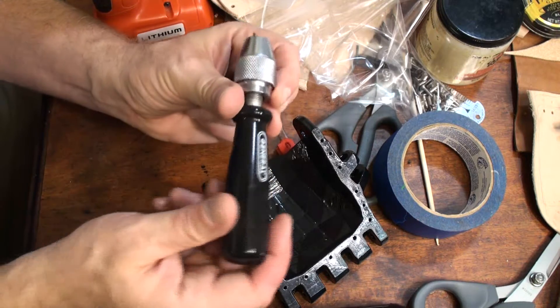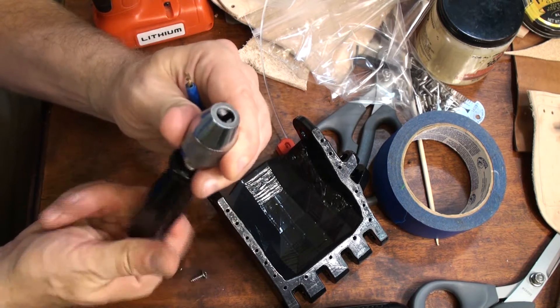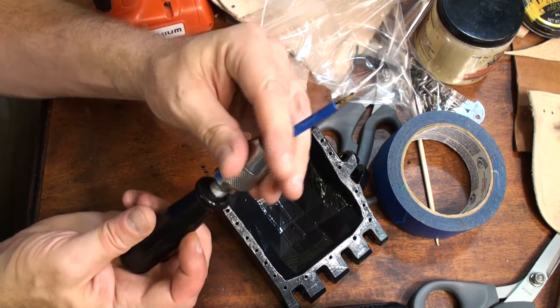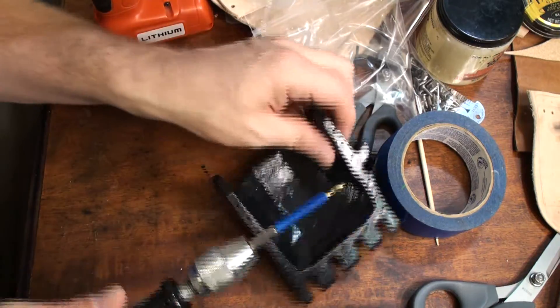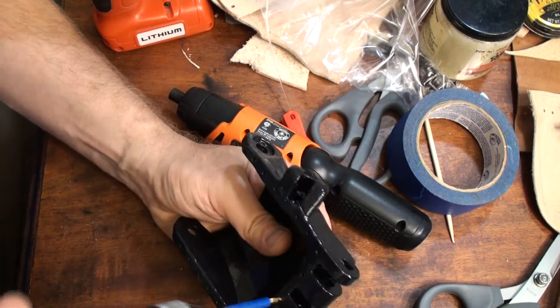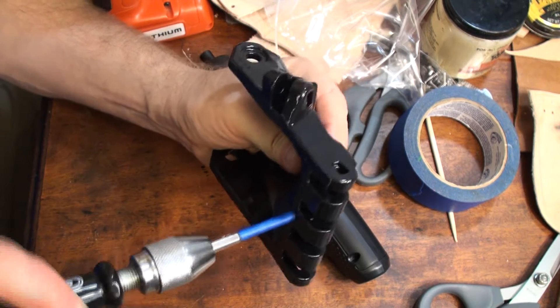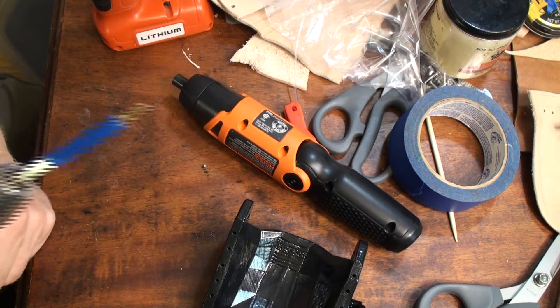One option I like a lot is just a $10 or $12 pin vise. You adjust the chuck to hold a drill bit — this is a hex bit so it's pretty wide, but this one will hold it. You just find a hole, then turn it until it goes up to the tape, and then pull it out. That was really easy.